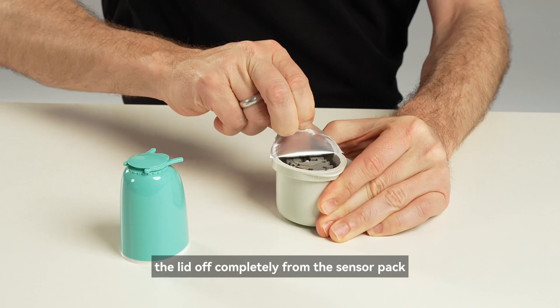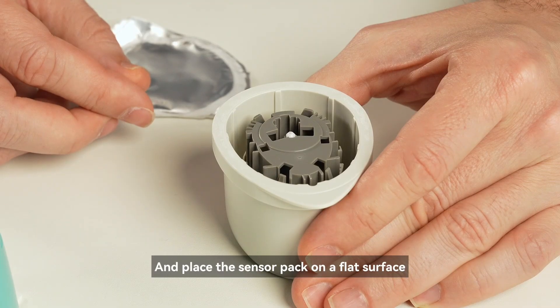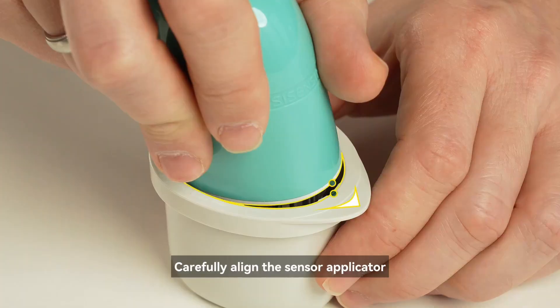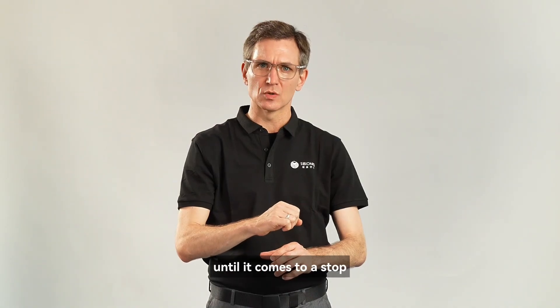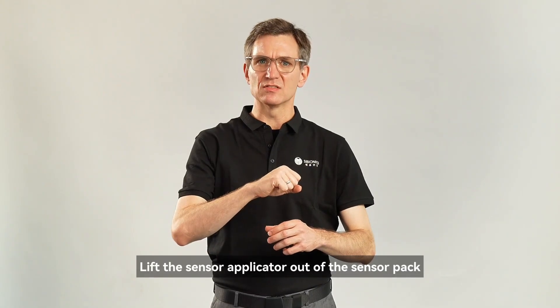Peel the lid off completely from the sensor pack and place the sensor pack on a flat surface. Uncover the cap from the sensor applicator. Carefully align the sensor applicator with the sensor pack. On a hard surface, press down firmly on the applicator until it comes to a stop. Lift the sensor applicator out of the sensor pack.